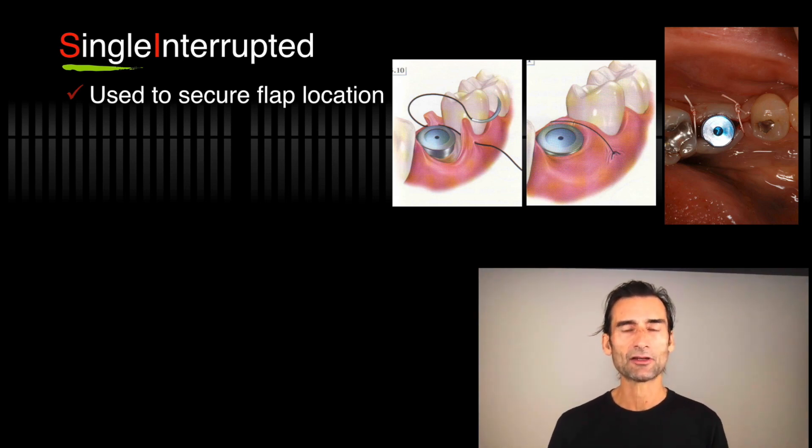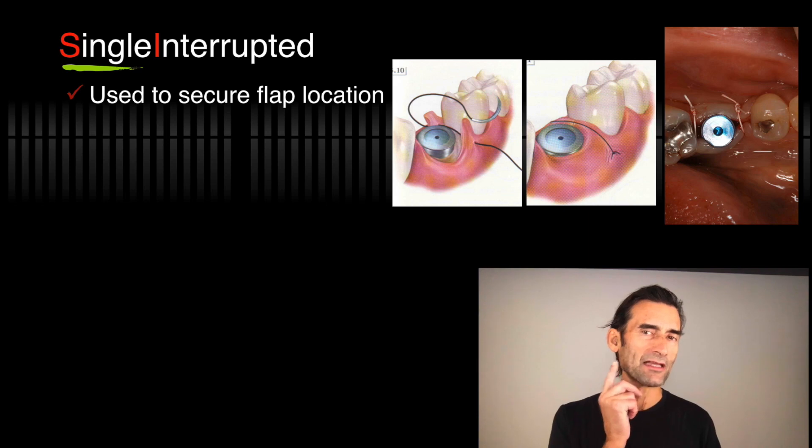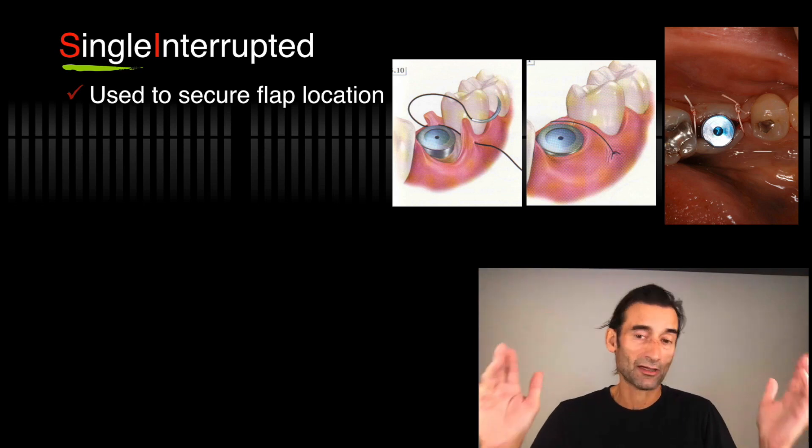If you do any kind of tissue-level implant placement and you have an abutment or implant there, you just need two single interrupted sutures — one mesial, one distal. It makes it so simple. A typical example would be a one-stage lower molar: place the implant, make a nice buccal-lingual flap, replace the flap, put one suture mesial, one suture distal, and you're done.